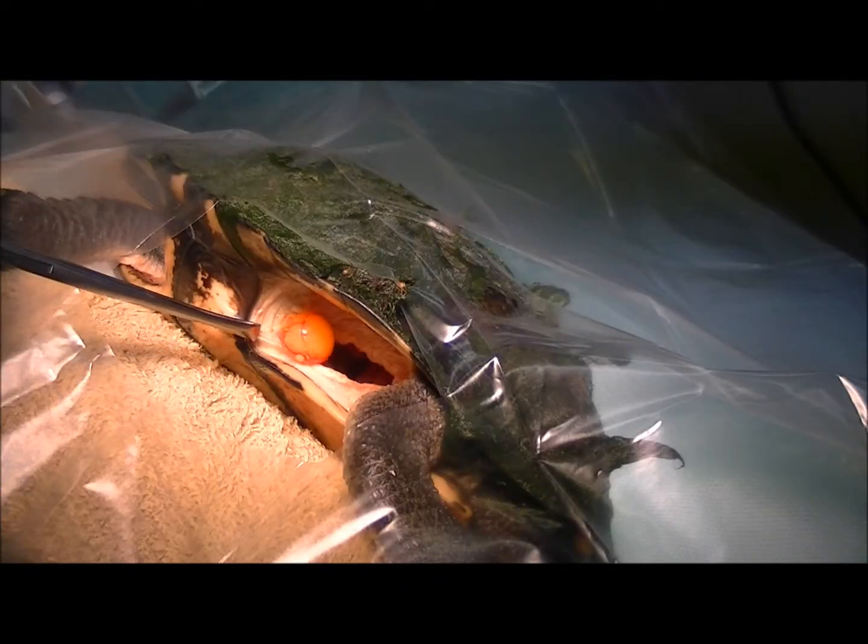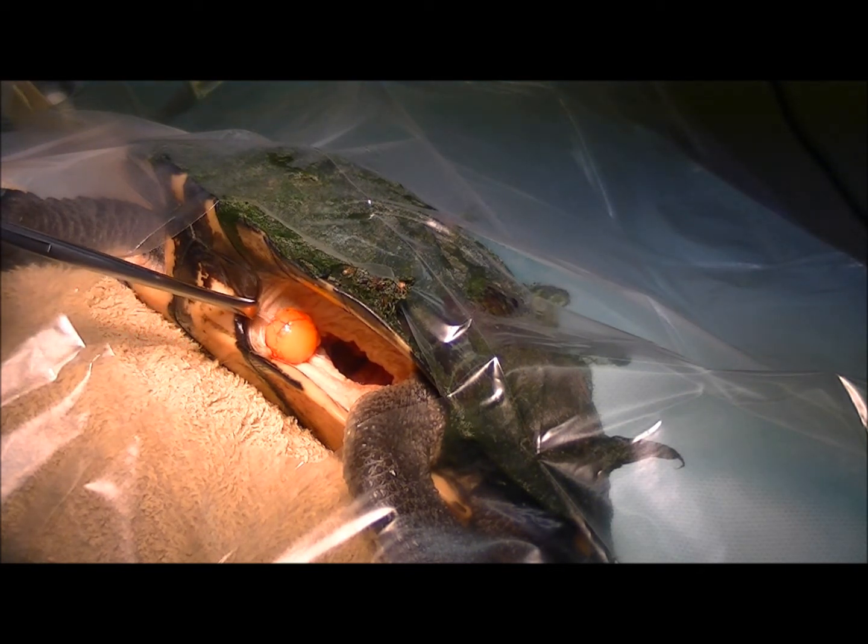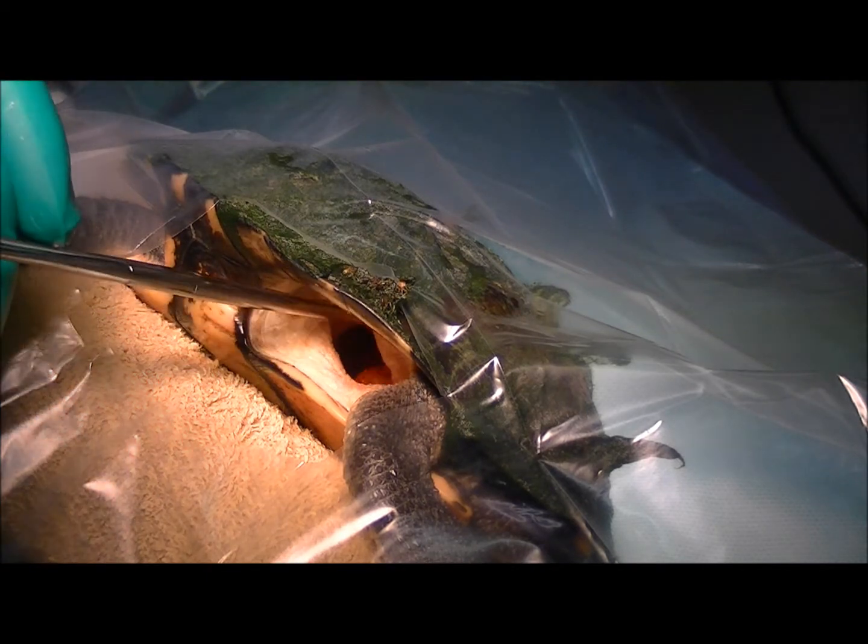This is a female turtle — that's an ovarian follicle there, nice bright yellow. That's basically the egg yolk of the egg, so that's not what we're after.